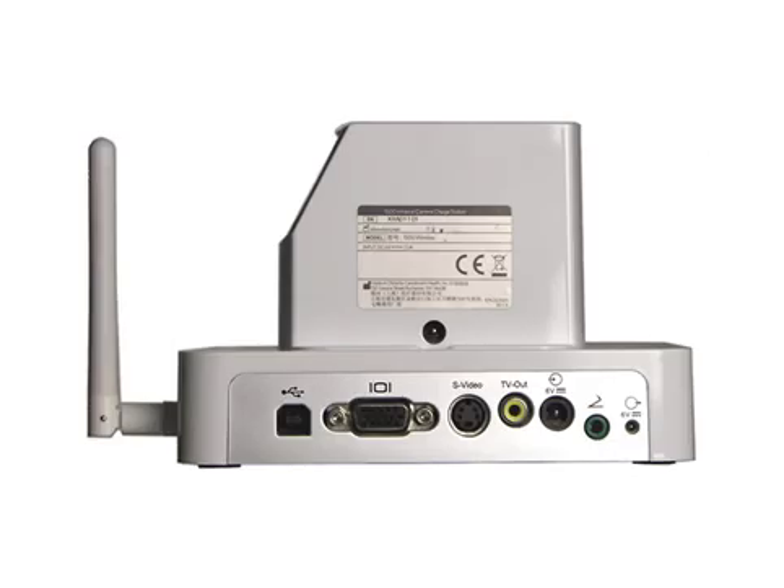On the back of the dock station are the USB cable connection, the VGA output, the S-video output, the TV output, the incoming power connection, the foot switch connection, and the charger power output connection.